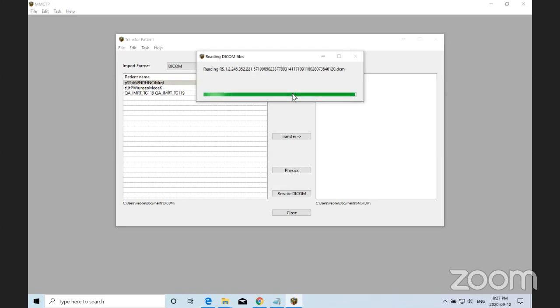I've run into a number of issues with folder names being too long, because the command to transfer the files from one system to another has a character limit to the absolute path. While this is actually important, when for example, for a given CT, you have multiple plans, I found that MMCTP does not know which dose matrix belongs to which plan.